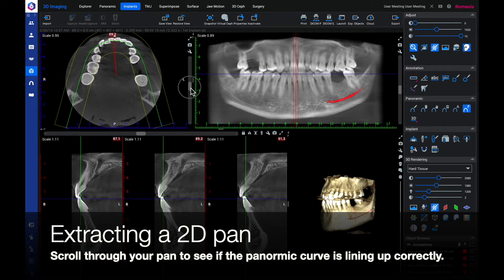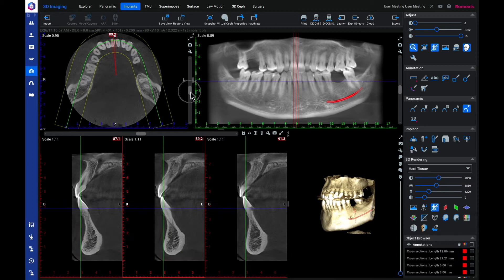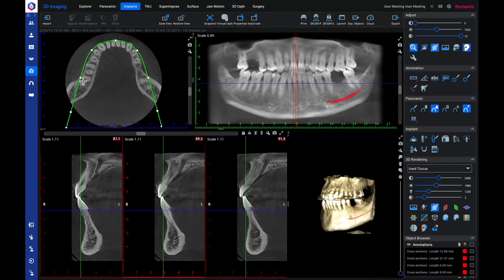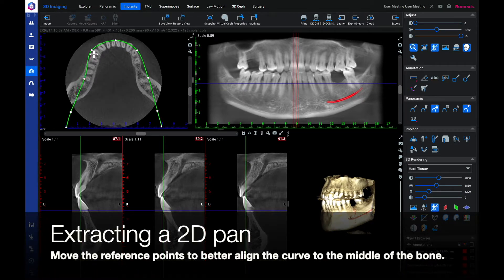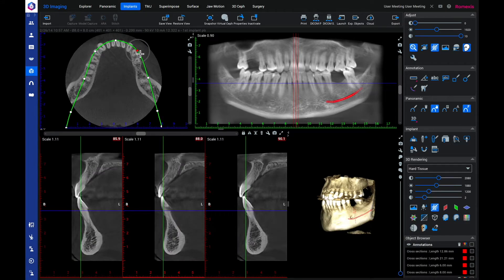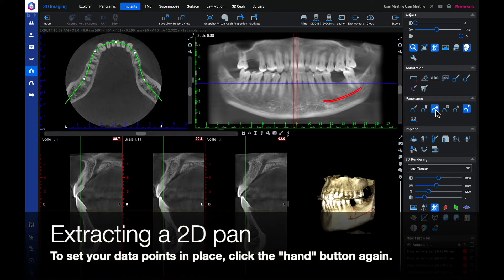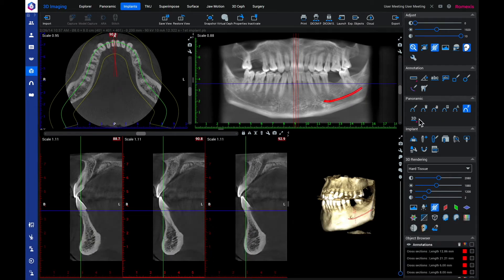Scroll through your pan to see if the panoramic curve is lining up correctly. If not, you can make adjustments by clicking the hand button. Move the reference points to better align the curve to the middle of the patient's bone. To set your data points in place, click the hand button again.